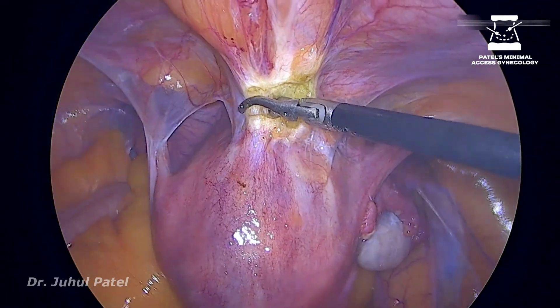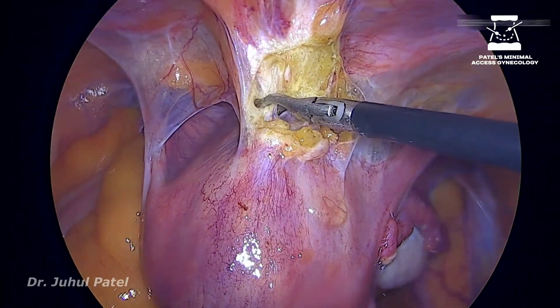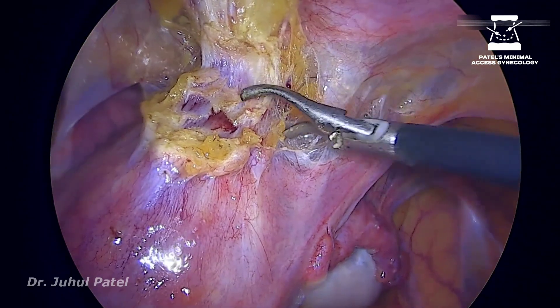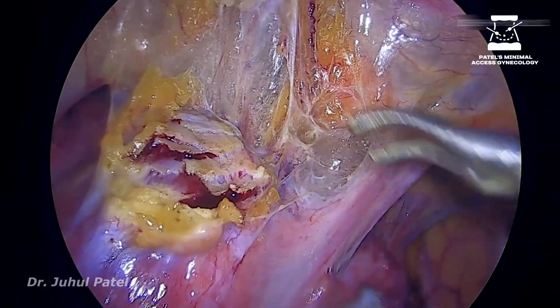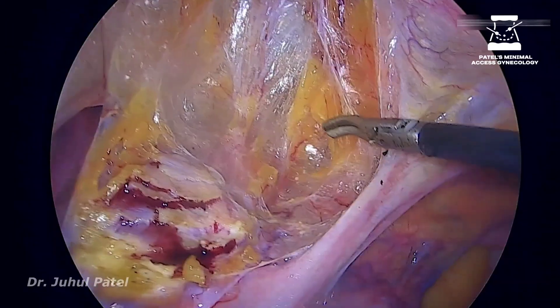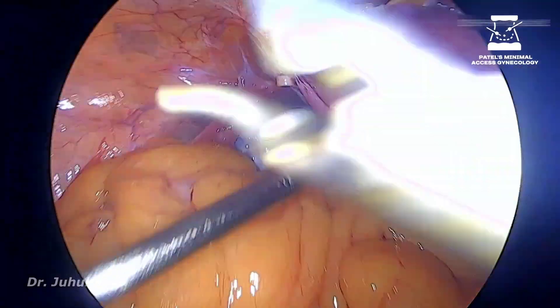What I am doing is I have come in with my instrument — the shears — and I keep on dissecting the tissue which is holding the uterus. Whenever I see fat, I keep on chopping below to the level of fat. As you can see, I have already reached the lower uterine segment.